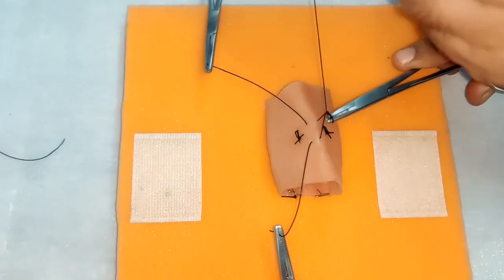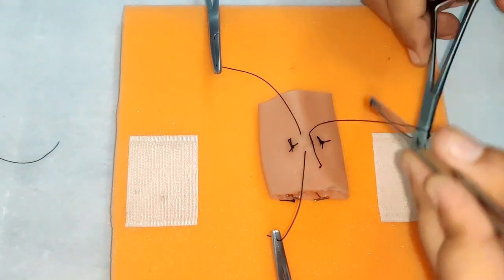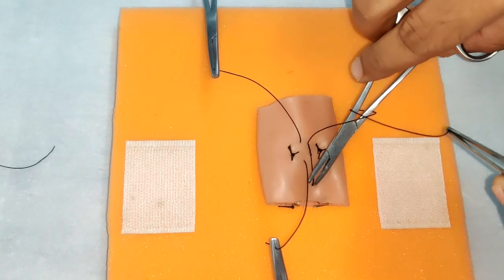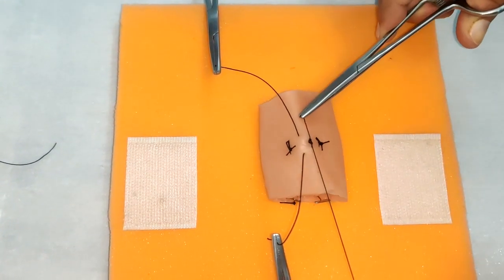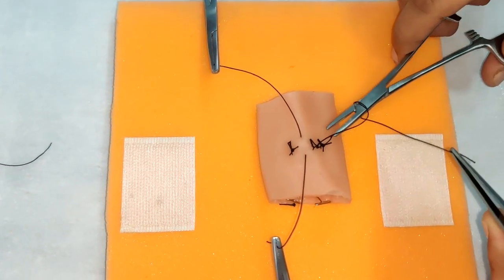Now we will come again in the center and repeat the same step. The advantage of this technique is that we can see all the edges while taking our sutures.